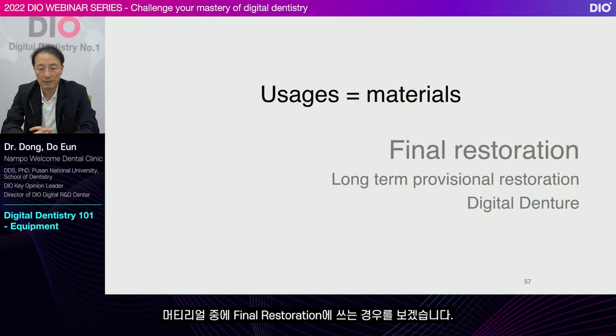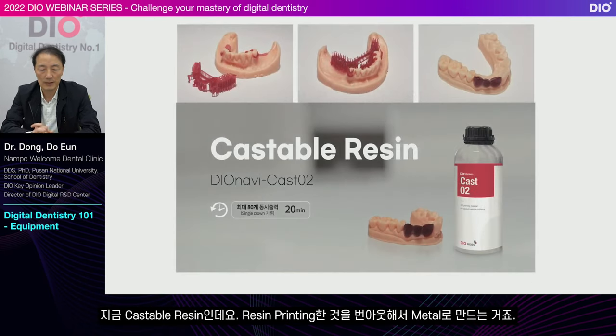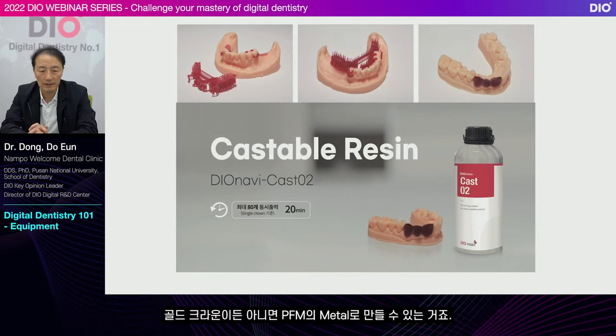Let's look at the materials for final restoration. This is castable resin. Resin that is printed gets burned into metal. It can be made into a gold crown or metal for PFM.